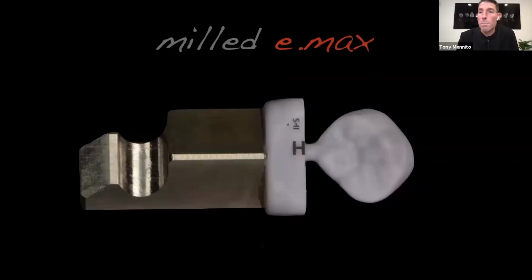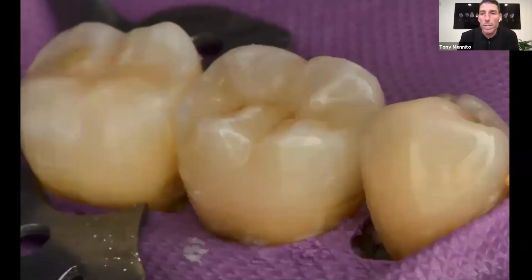Here is what milled emax looks like coming out of the plan mill. I have a plan mill in my practice. And here it is after it's been stained and glazed and fired in the oven for about 15 minutes. And this is a bonded emax restoration. Once again, you can get really good aesthetic results with this material with just a little bit of effort.